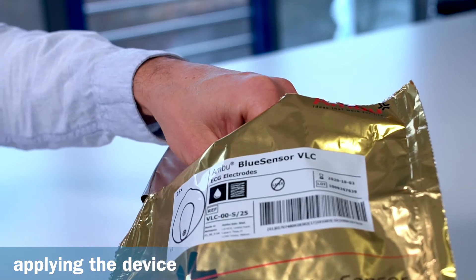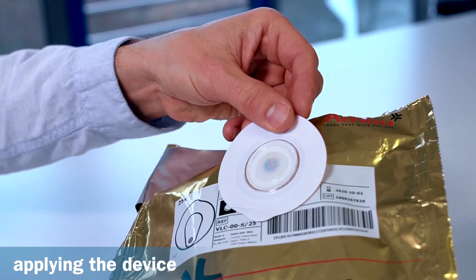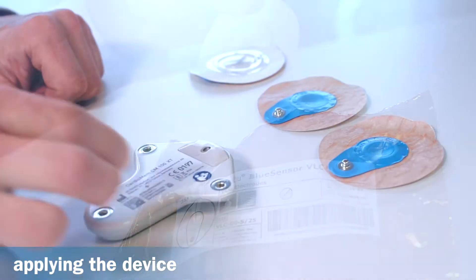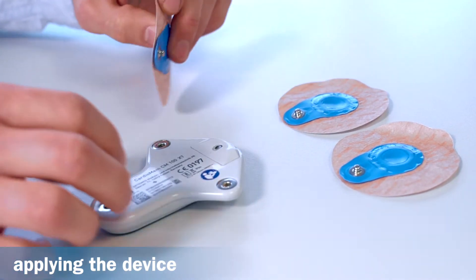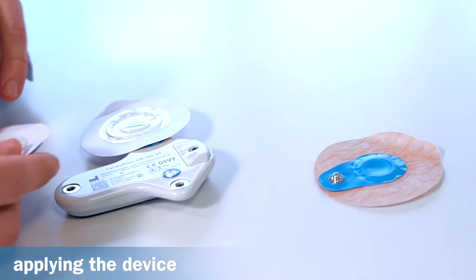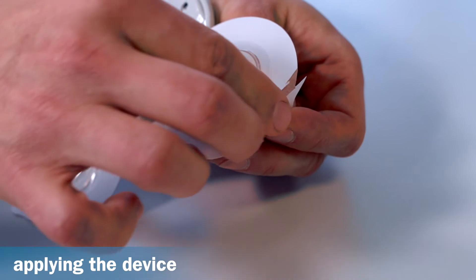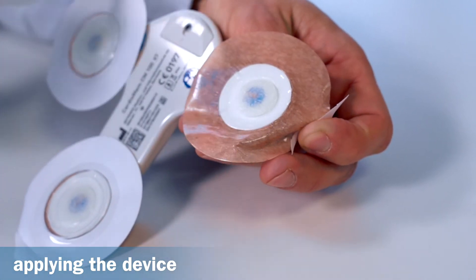The patient should therefore be given a sufficient amount of electrodes to cover the planned monitoring period. To attach the electrodes, proceed as follows: place the recorder face down on a flat surface, take three new disposable electrodes with their protective film still attached, snap the electrodes into the connections on the back of the recorder, then carefully remove the protective film from the electrodes and avoid touching the gelled surfaces.